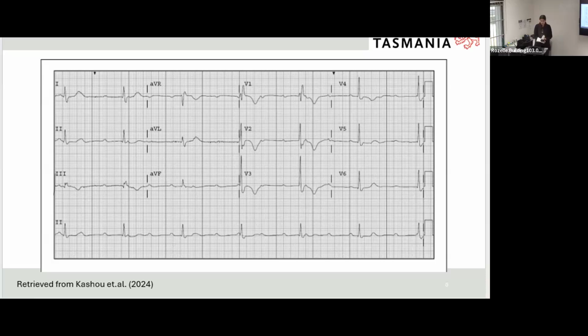In your textbook there should be an example of an ECG calculator, but I can't find it. If I work out the page, I'll try and work it out at a different time. Basically, in your textbook will be an example of an ECG calculator where we used to use that piece of paper, which is the method that you're talking about, John. Now we usually rely a lot more on the interpretation from the machine in terms of regularity and rate. But the ultimate method is to use the piece of paper method that you're talking about.